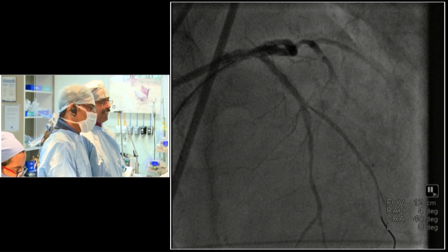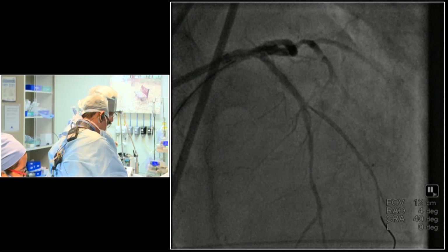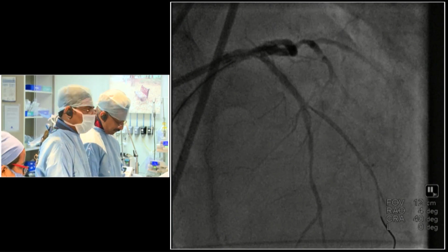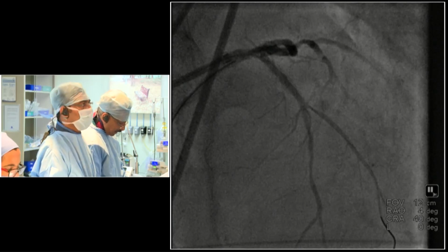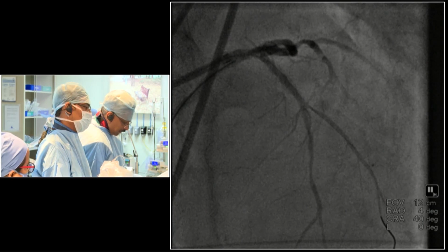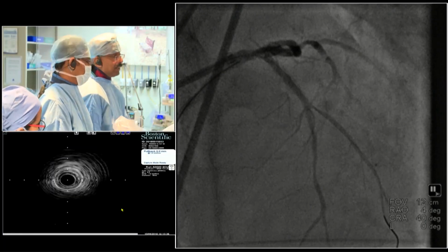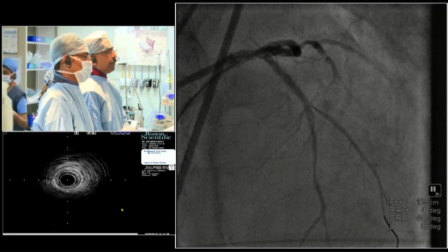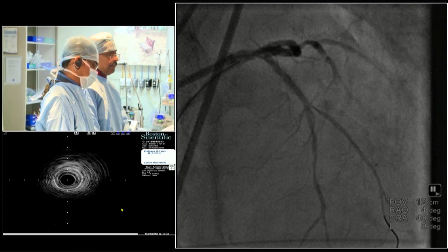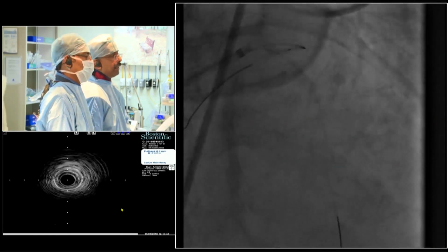So are you okay with that? I don't think we have a choice. I think there's a lot of disease. We can't avoid that now. We'll have to keep a segment intramyocardial. We'll show you the IVUS again. So what we are planning to do is an IVUS to see whether we are okay to get a stent now. And we will plan to do 2 stents, one in the distal LAD, in the mid LAD, extending into the proximal LAD.